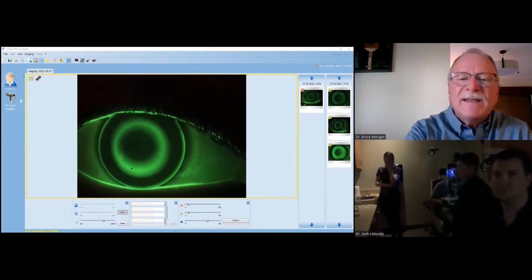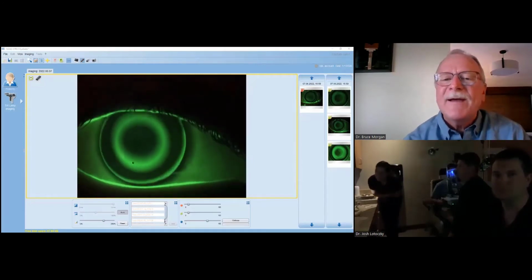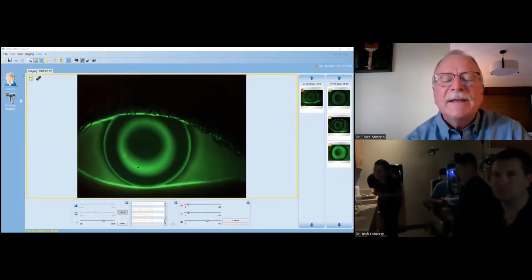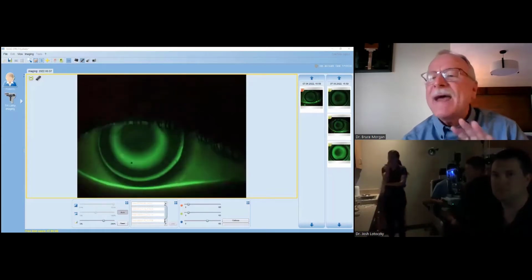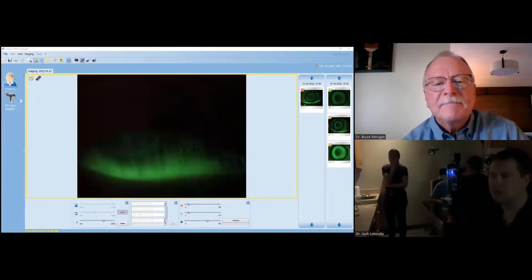See, that's where the fitting is occurring. See how distinct that band is? It's even all the way around. It's showing really, really good alignment. And therefore, if you see that, in the ballpark, we're going to dispense it. Yeah, I would totally agree.